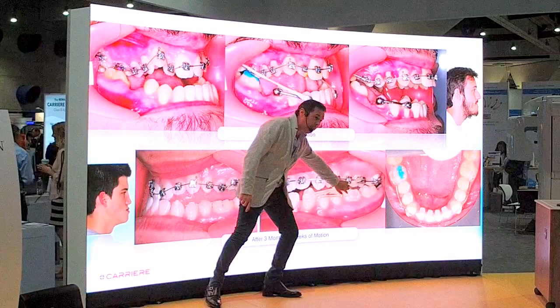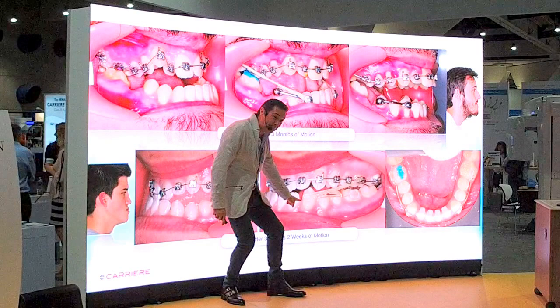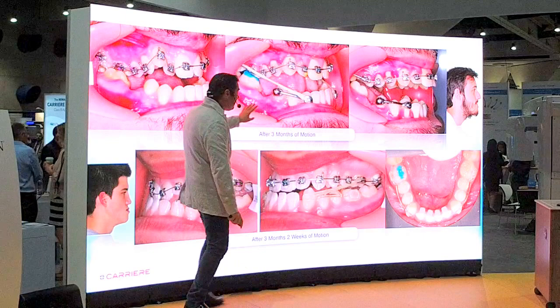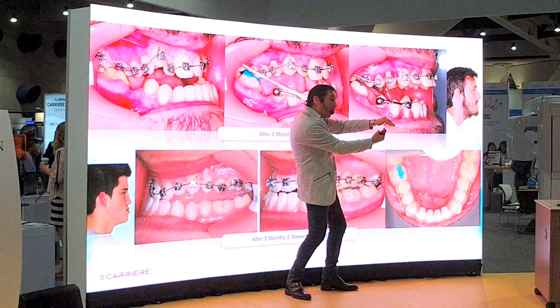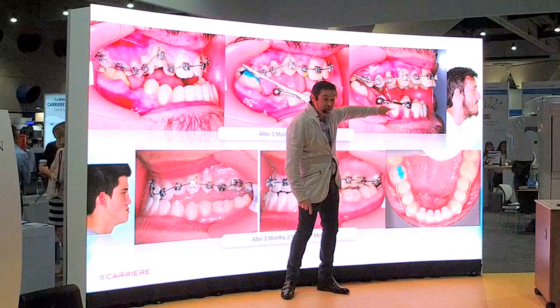Once we are with the rectangular wire, we switch into the motion appliance. Once we accomplish the sagittal correction with the motion, we will exhibit spaces between the lower incisors and exhibit a positive overjet. The same happens in the open bite case — we place the brackets, place the motion, and accomplish a positive overjet. Here we had a negative overjet, but now we have a positive overjet.